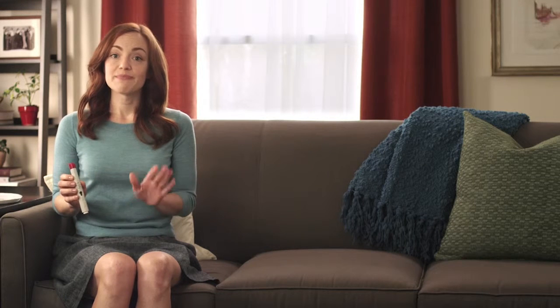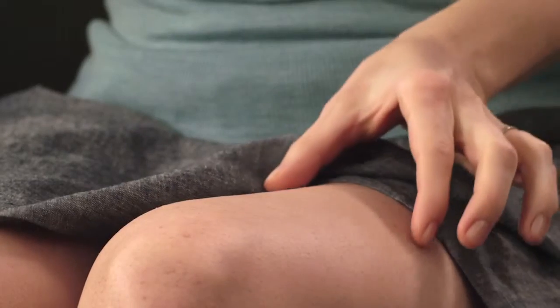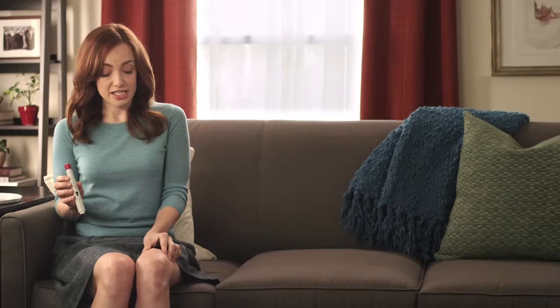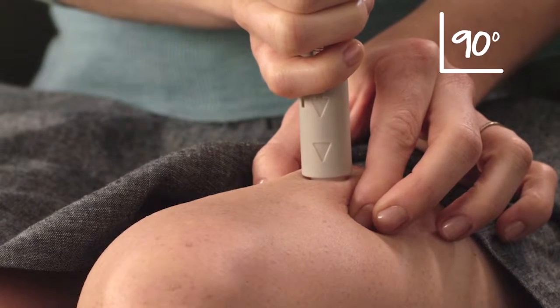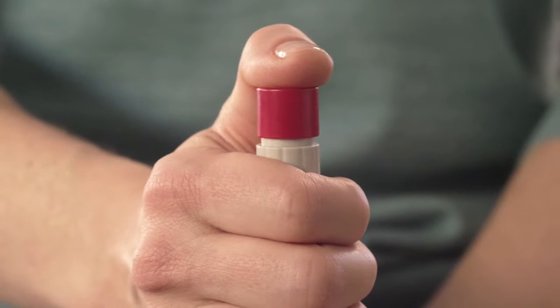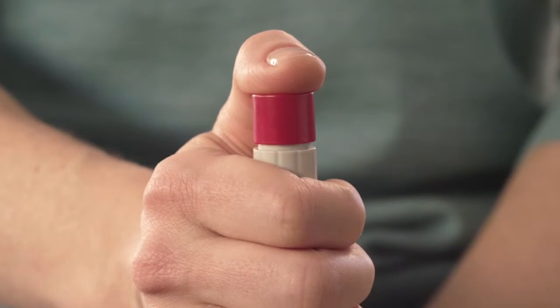If you're a little nervous, that's to be expected. I find that taking a deep breath at this point definitely helps me. With my free hand, I'm going to gently squeeze the area of skin that I've cleaned and hold it firmly. I'll place the white end of my pen straight at a 90-degree angle and flat against my skin, then I'll press the plum-colored button. The loud click you'll hear signals the start of the injection.